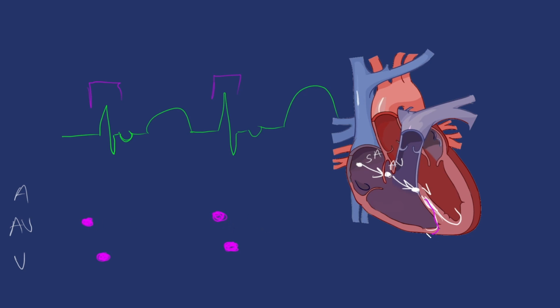So we're backtracking here. The ventricles have depolarized like normal. It came from the AV node to do that. So we know so far it's come from there. But do we see a P wave? We don't see anything here. So nothing has actually triggered the junction to start this. We do have this weird thing over here, which is an upside down wave that would be small enough that it's coming from the atria, right? But it's not sinus, and it's going backwards. So what's happened is this is going this way, and this arrow is going this way. So the rhythm is starting at the AV node, or the junction. So this is a junctional rhythm.